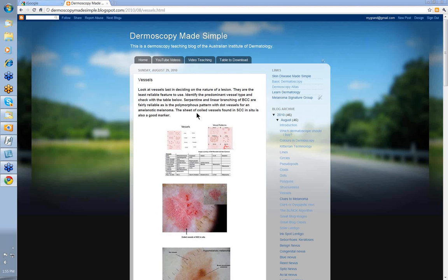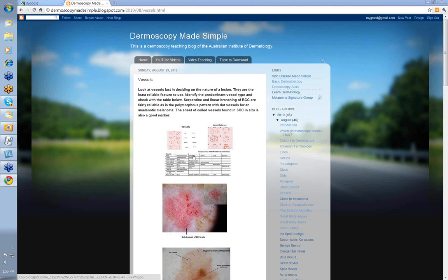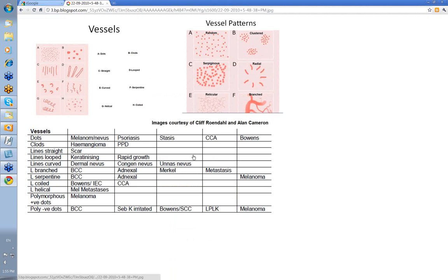As a tumor grows and thickens, these vessels become more variable with twisting and turning. Sometimes you'll get some coiled vessels, and they also tend to course over the surface of the tumor. So you'll see features of linear branching that's similar to basal cell skin cancer, but it's just related to the thickness of the tumor and the way in which the blood vessels grow to supply it with blood.